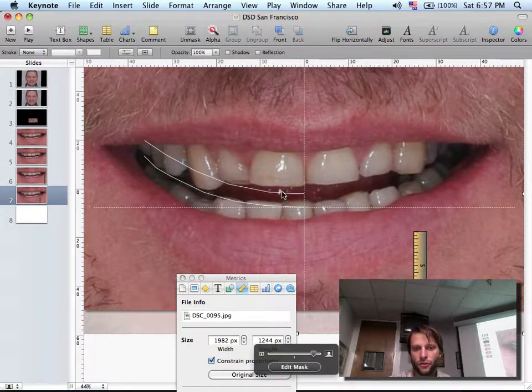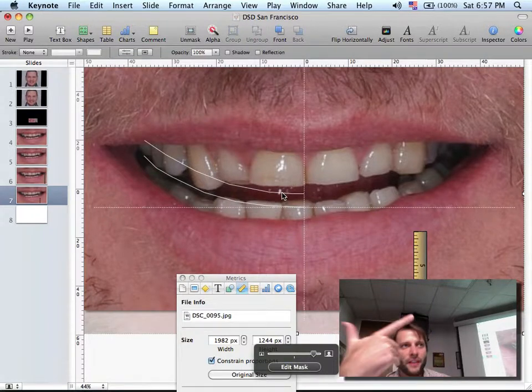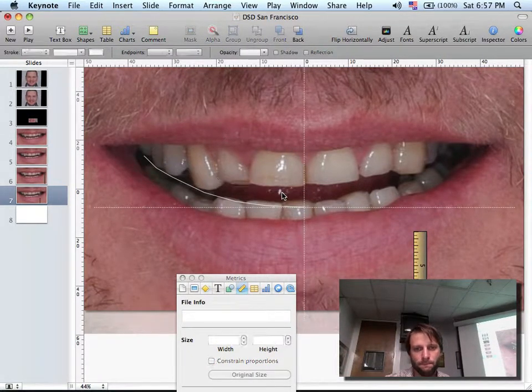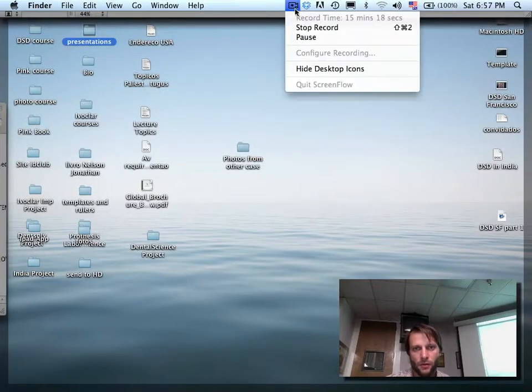Okay, so you can make the first drawing, you can reactivate the dots, change the position of the dots, you can reactivate the last dot and continue to create dots, and then double click, you finish the drawing. Now don't worry, I'm gonna help anybody that needs help.